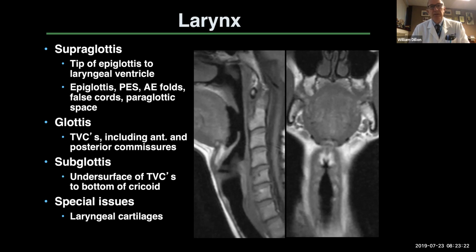The most important things I think we want to remember is, number one, that infection can be very devastating, and we don't want to miss that. We don't want to confuse a benign branchial cleft cyst with cystic metastasis, and so we'll look for septations within the cyst or nodules. And we want to also pay attention to perineural spread of tumor. When we find a tumor, think about the nerves that are in that area and watch them and carefully go back, and you won't miss those sorts of things because then the radiation oncologist or surgeon can deal with that appropriately.